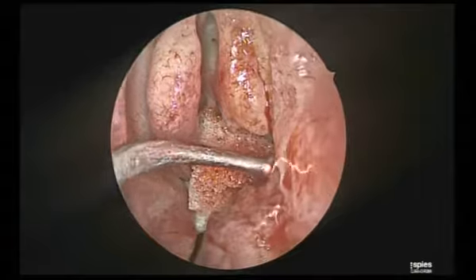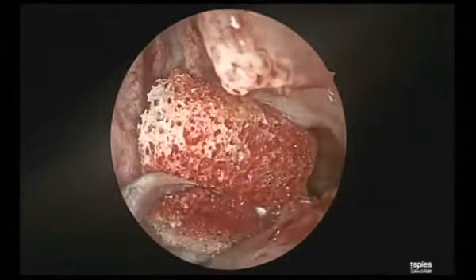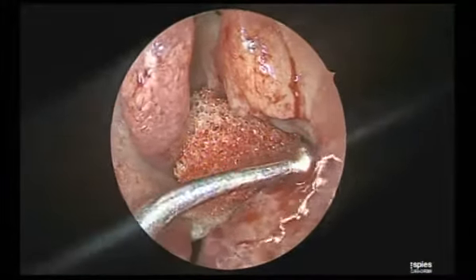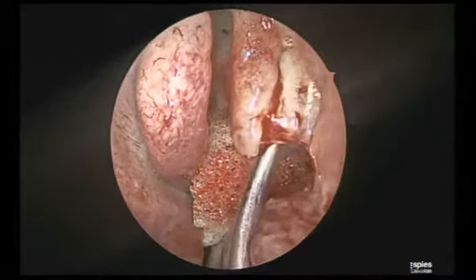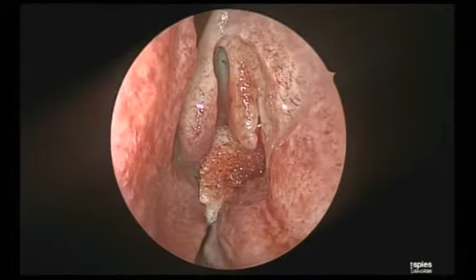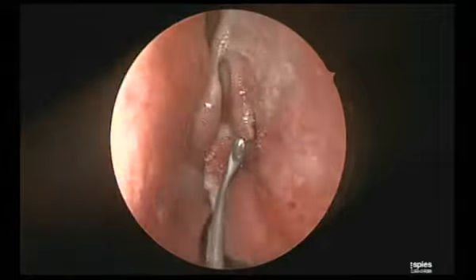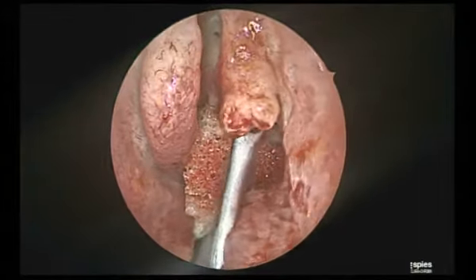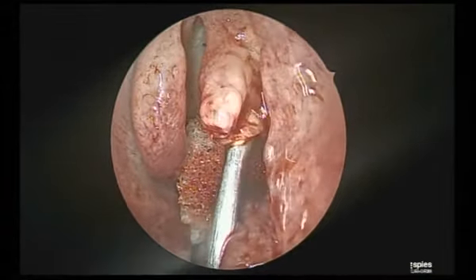So if you bend it inferiorly, you stay away from the nasolacrimal system. That's the important thing. Second thing is, if you come across any hard bone while biting through, see, this nasolacrimal system is composed of 3 bones. The thickest one is this frontomaxillary process. So if you come across a thick bone, you need to stop and see that you don't bite through the nasolacrimal system. Now what I am doing, posteriorly you can go as much as you can.